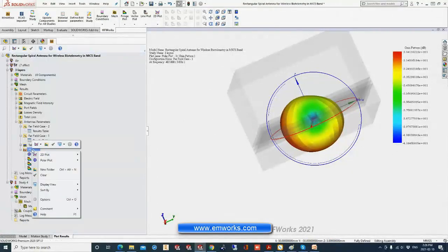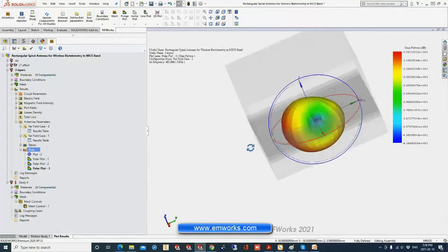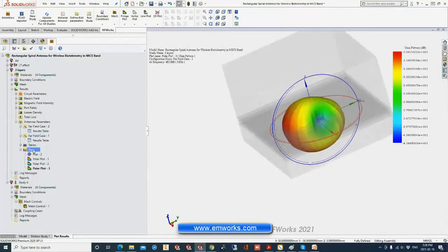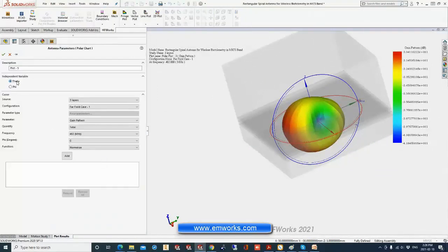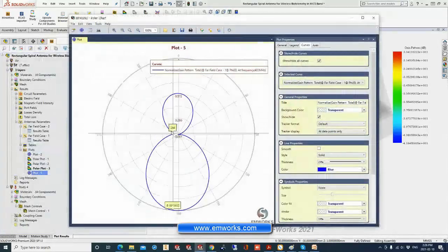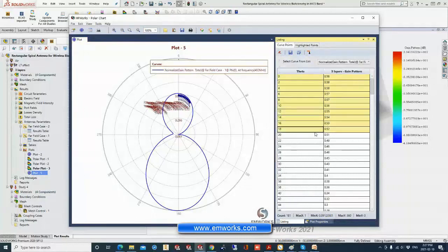We can actually make a section view of this gain by using a 2D polar plot, and we can fix the phi and vary theta, for example, gain, and we can here check the gain or the directivity versus theta. This is the theta angle, and you have the gain value.